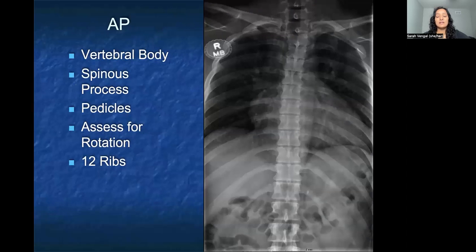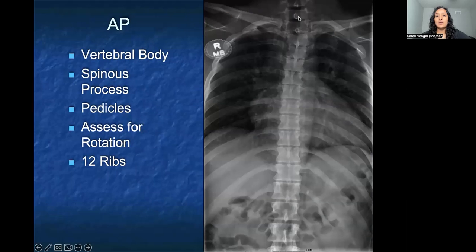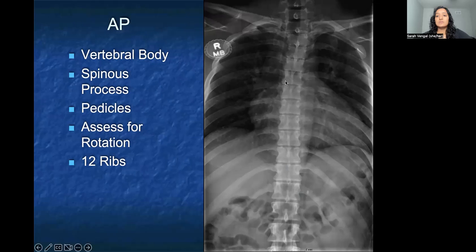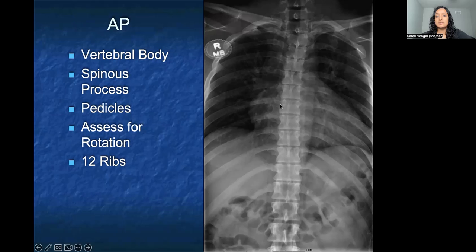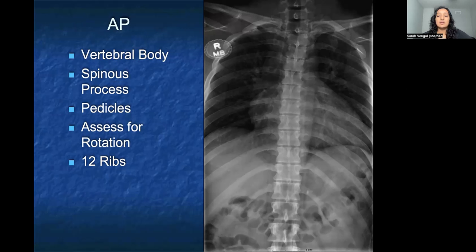When you look at the AP of the thoracic spine, you want to make sure that you're looking at each vertebral body to assess whether or not those heights are maintained and whether or not they are relatively uniform in shape. When you look down the center of those vertebral bodies, you can see these circular opacities throughout, which are actually the spinous processes that you can see straight through the back. On either side of the vertebral body, there are also pedicles that you can see, which are nice and round and circular. The outside of the circle is the outside of the pedicle, whereas the center is the center of the pedicle. You're looking to make sure they are uniform from side to side, and that it doesn't look like one side is smaller than the other.